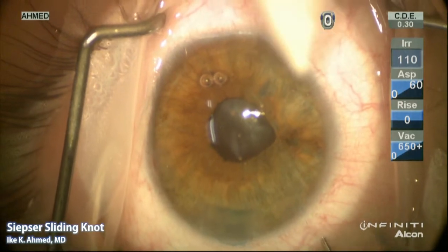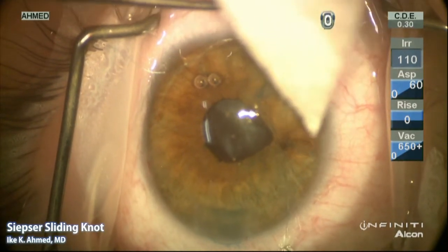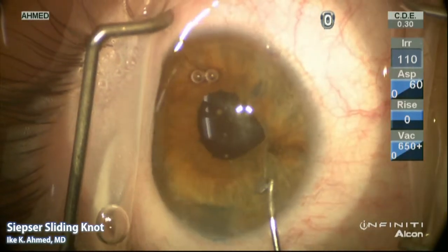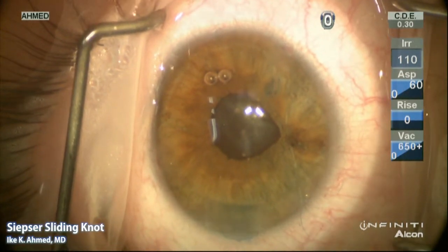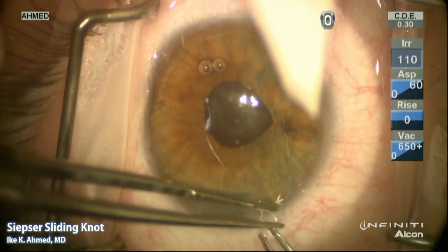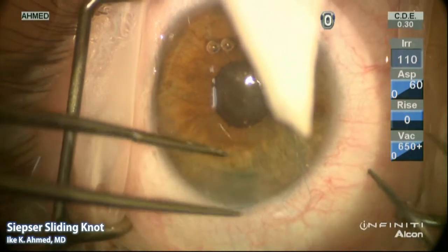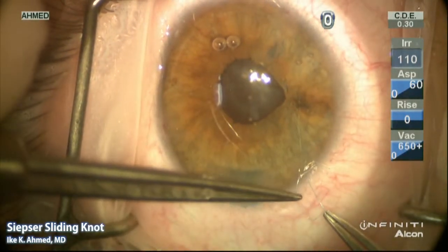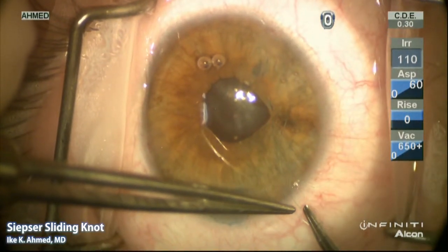It's very important to distinguish between the distal and proximal strand and the respective paracentesis through which each suture strand emerges. We will then use the Kugeln hook one final time to loop the distal strand, creating a distal loop. It is twisted slightly, so we untwist it to ensure that the number one part of the distal loop is oriented to the left side of the view, going directly through the distal paracentesis as seen at the top of the screen.